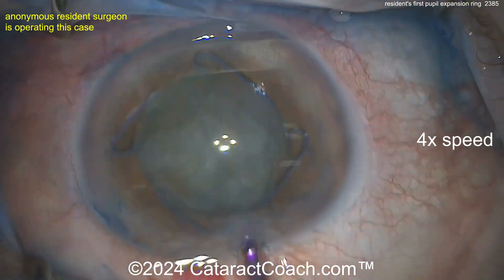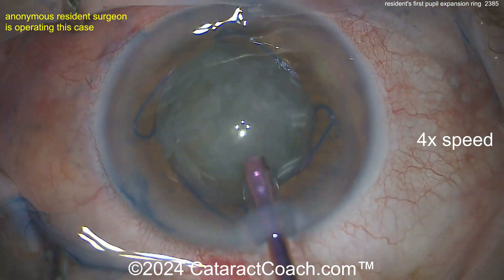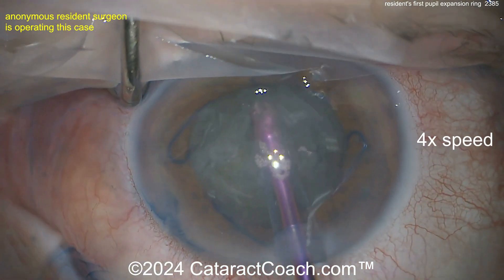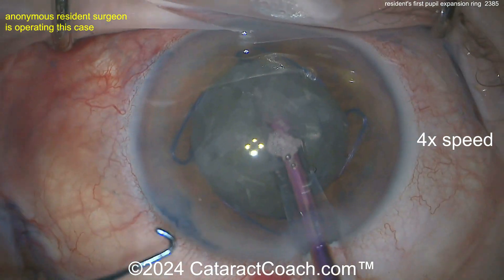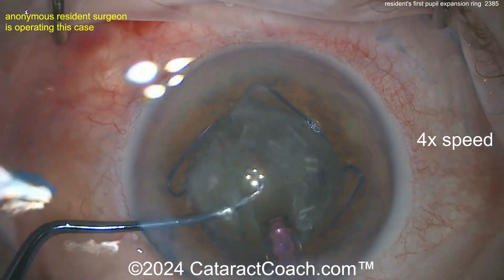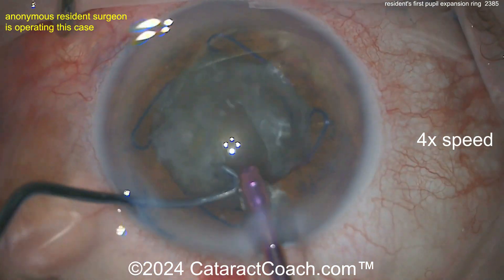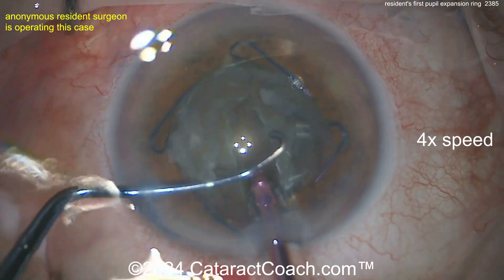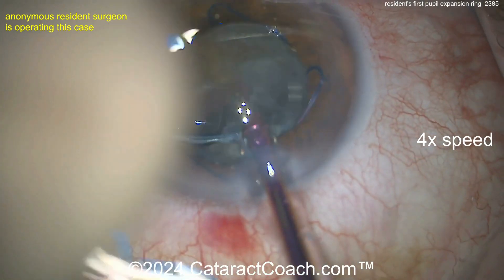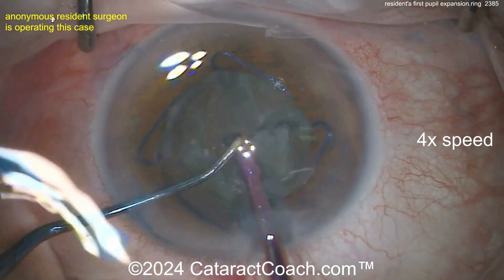The nucleus is spinning very nicely — you know the saying, if it does not spin you will not win. Now getting that phaco probe in there: you're really damaging that incision, you've got to be much more careful or you will one day get a bad Descemet's detachment. Now let's see a groove down the middle — I'd aspirate some of the anterior lens cortex too to give yourself a better view. Good groove, and it looks like a stop and chop.